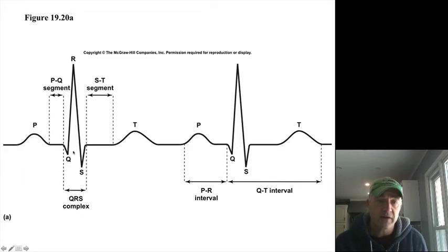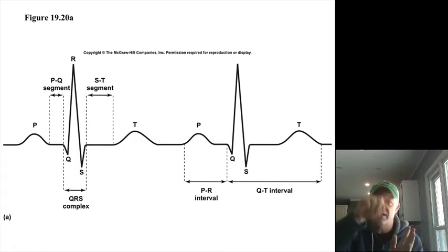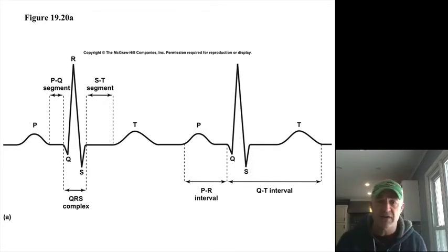The other thing to point out is this QRS complex should be a very steep curve, like an A. There should be no jagged edges on it. It should go steeply up and back down. If there are any bumps or spreading out, that means conduction is not going well down through the ventricles and could be an issue.